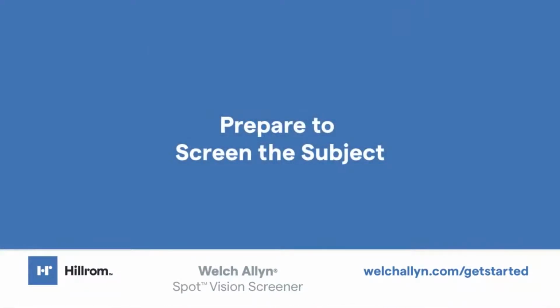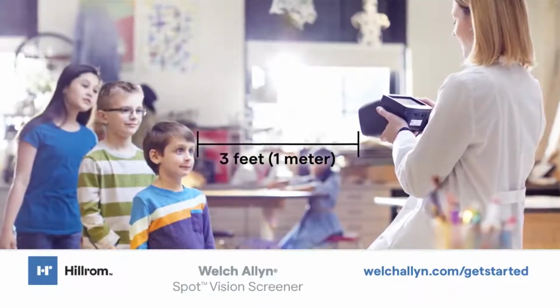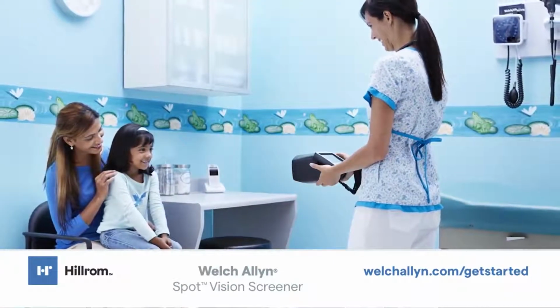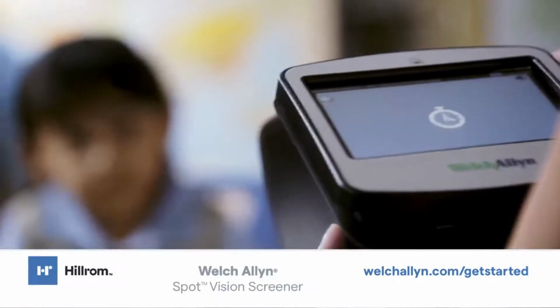Prepare to screen the subject. Stand approximately 3 feet, 1 meter from the subject. Hold the vision screener so the front is level with the subject's eye. Keep the vision screener steady. Touch Go. The screening begins immediately.